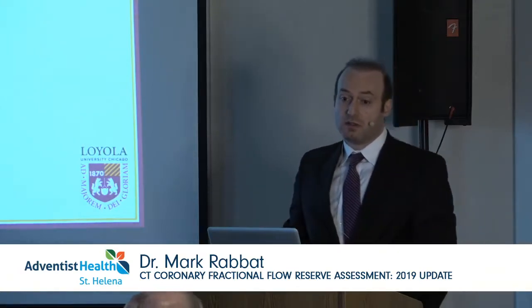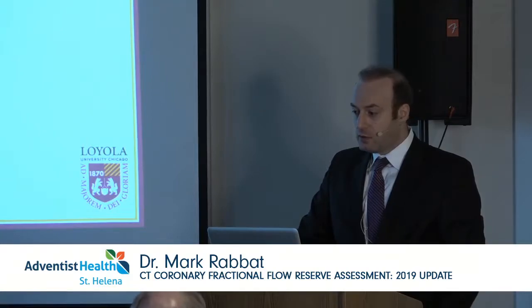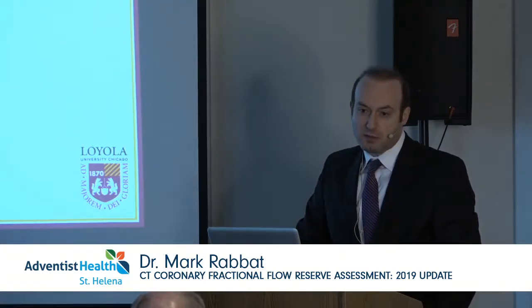And how much contrast do you normally give them now for a CTA? Yeah, so contrast about 70 cc's, I would say. And depending on the scanner that you utilize, depending on the type of gating you utilize, whether you perform prospective or retrospective scanning, oftentimes now many centers are doing prospective gating with perhaps some padding. I mean, we're talking millisieverts less than 5, consistently. So yeah, 70 cc's of contrast, I'd say around 5 millisieverts of radiation.